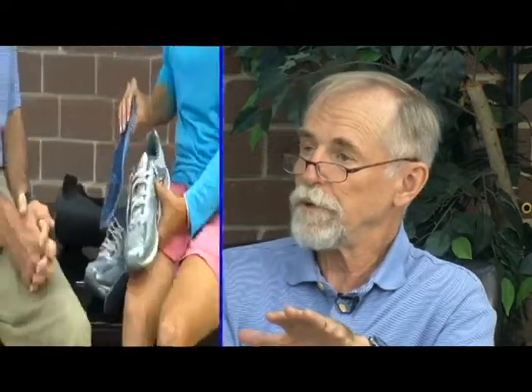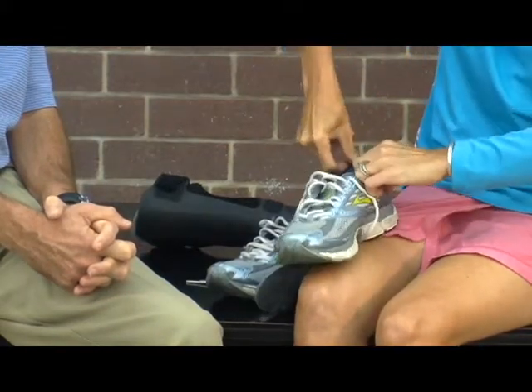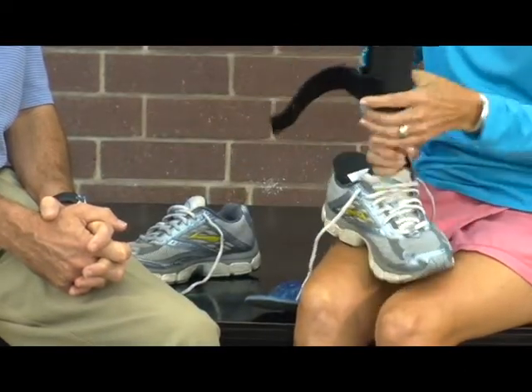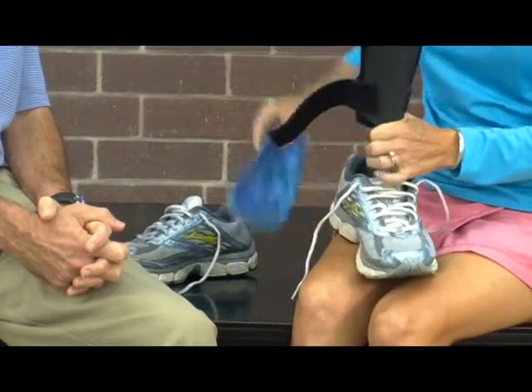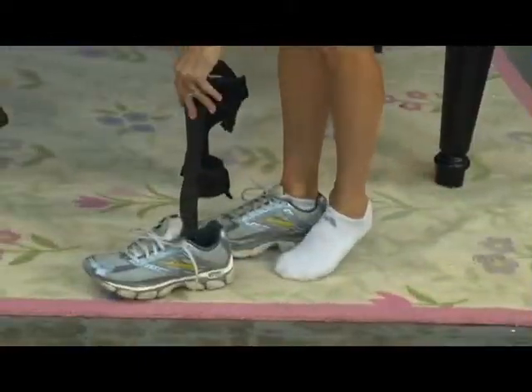I remember I had specific pain as my foot was rolling toward the strut and I was having knee and hip pain that I was very concerned about. So you basically customized the brace by creating a custom insert. One of the key things I did was try to put you in a position where the foot was in what we call a neutral position — subtalar neutral — referring to how the bones are aligned so that the foot is in a neutral position. We customized the insert so it puts you in subtalar neutral. Because you land in supination, that meant we had to do some medial posting or cushioning for that, and we added a little bit of a lift to equalize the leg length difference.